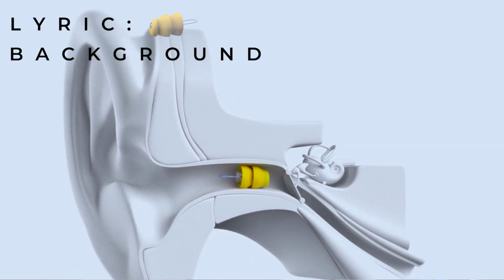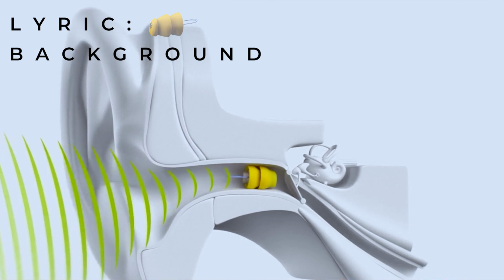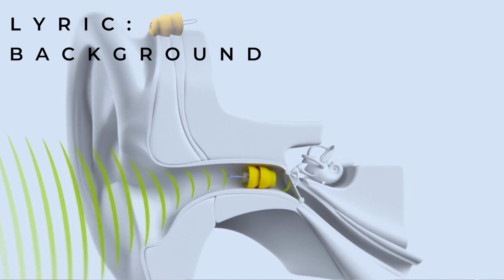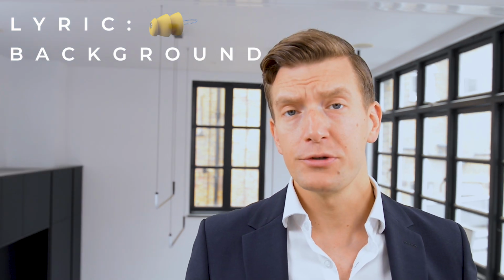And what I mean by that is it's placed in the ear canal. We put it in under microscope, so it's an audiologist that needs to insert it, and it's left in there for between 2 to 3 months at a time. This is why it's dubbed the contact lens of the ear. The audiologist that fits Lyric needs to be specially trained in fitting Lyric, and after a 2 to 3 month period, you need to take another trip back to see your audiologist. They'll take it out using a special tool and reinsert another one.